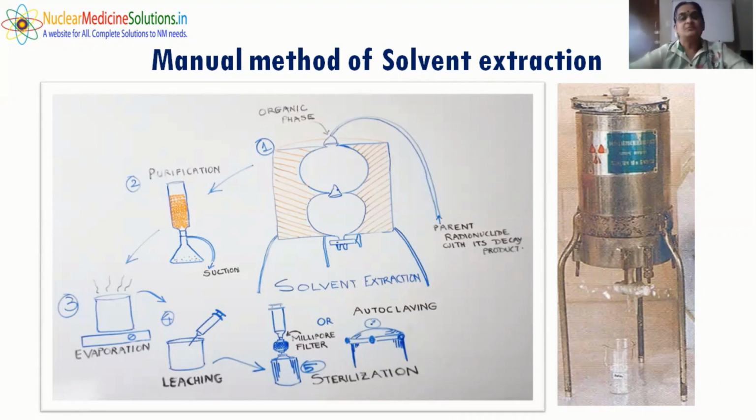So as an experiment, it is very important to understand these fundamentals. For me, in my initial professional life, it was the way in which my patients used to get technetium-labeled radiopharmaceuticals. It was the cow that I used initially to milk the main ingredient of the radiopharmacy.